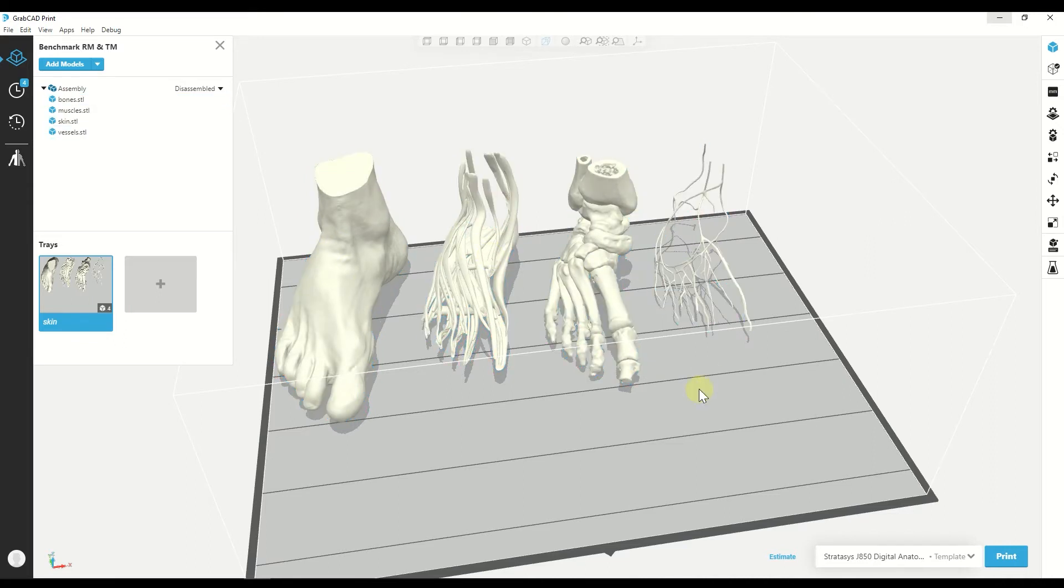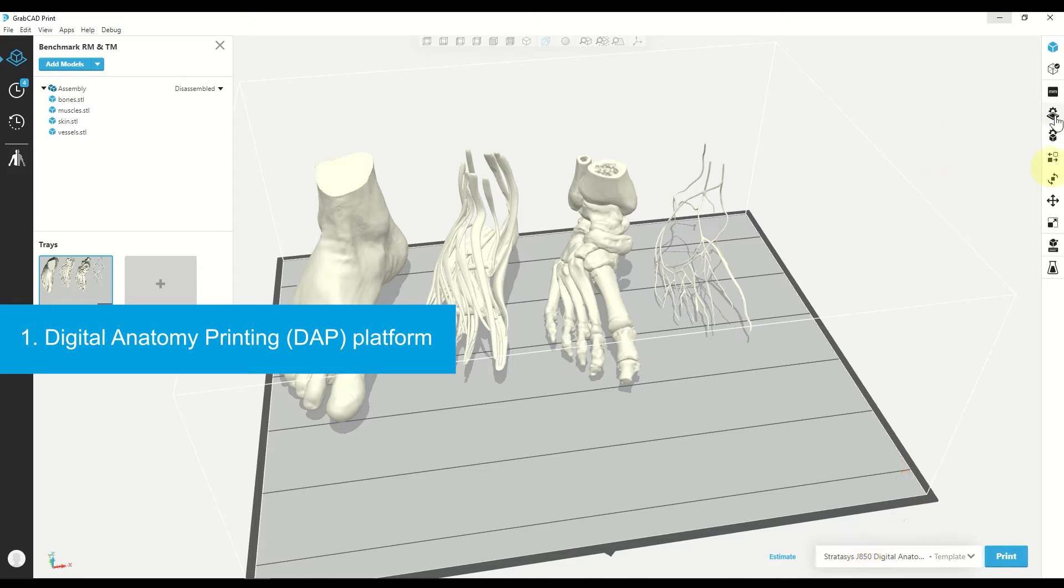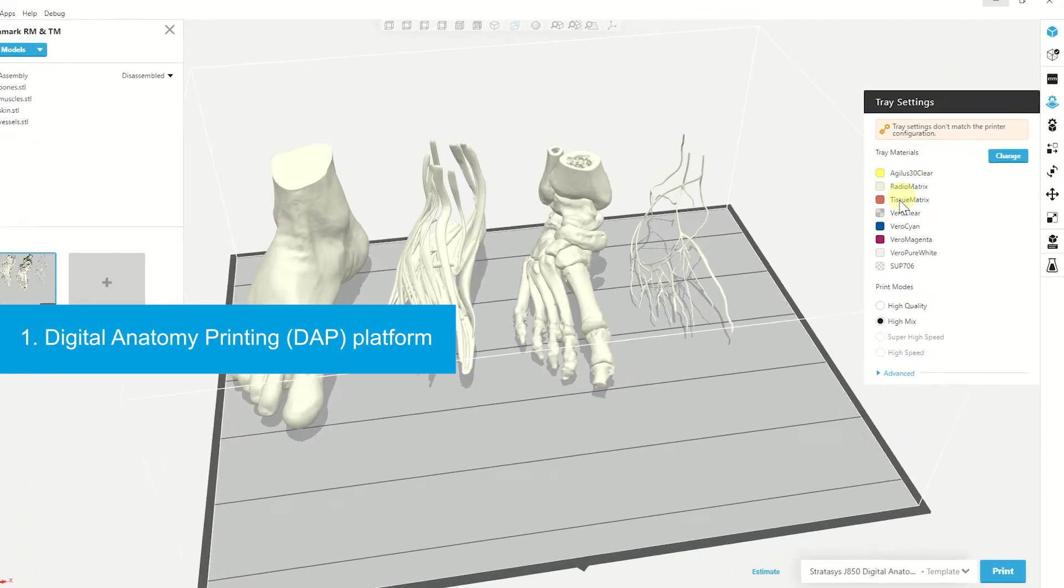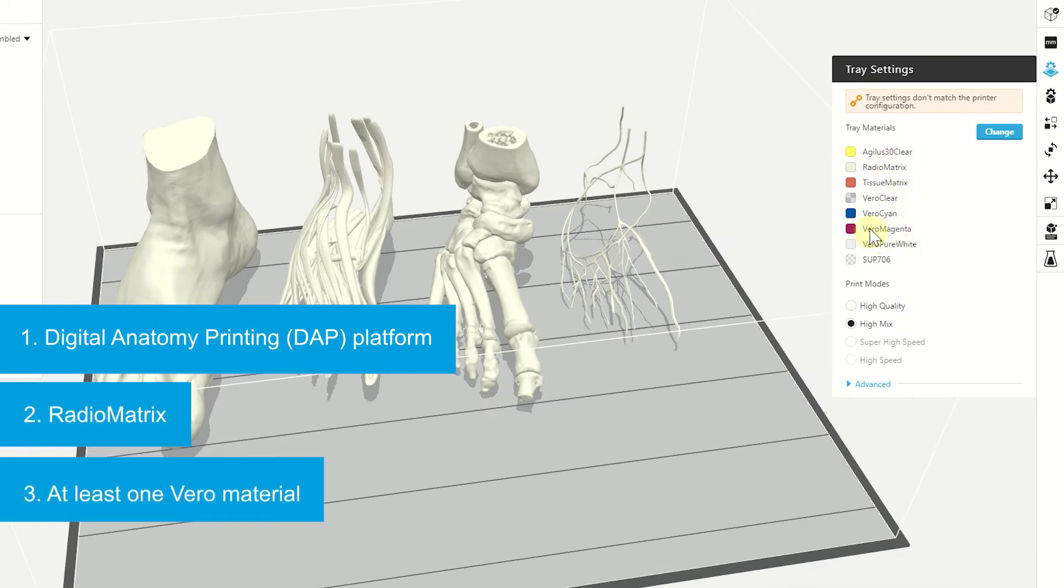In order to use the Radiology family, we need to have a digital anatomy template. So it can be J850 or J750. And we also need to have Radiomatrix loaded in our printer and at least one of the Vero family materials.